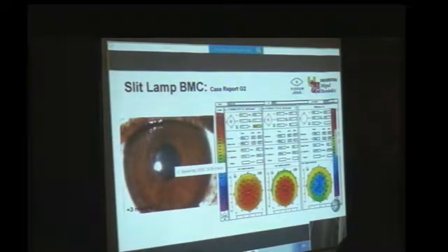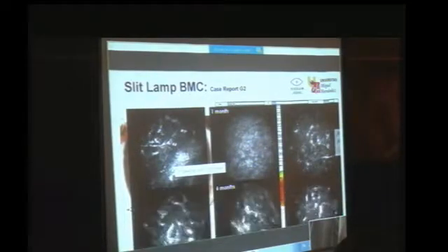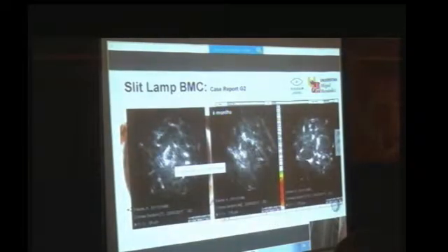Changes in the topography were toward flattening, and we could observe that following 6 months there was an invasion of cells in the lamina. So the lamina was implanted with no cells, but after 6 months we could see cells, obviously keratocytes from the same patient, colonizing this lamina, which is remarkable. See here after 6 months how we have this lamina colonized by cells that were only coming from the same patient.